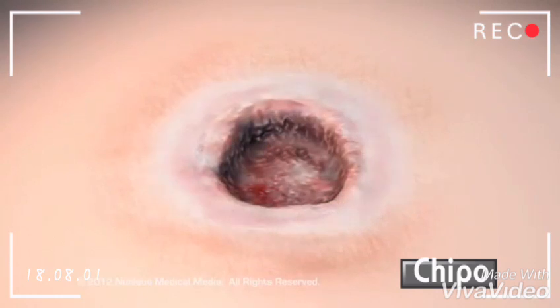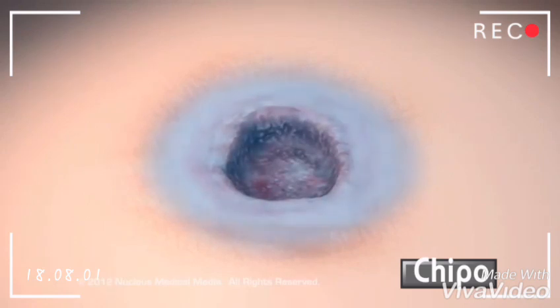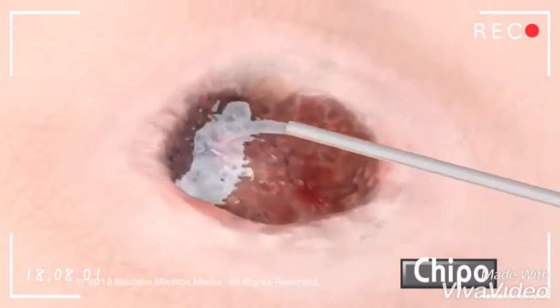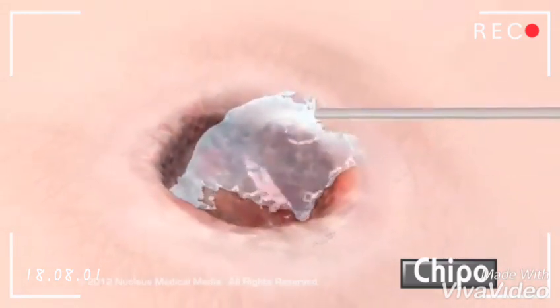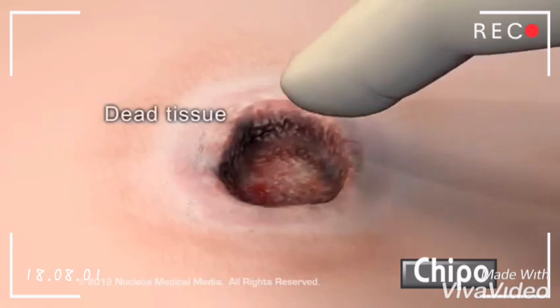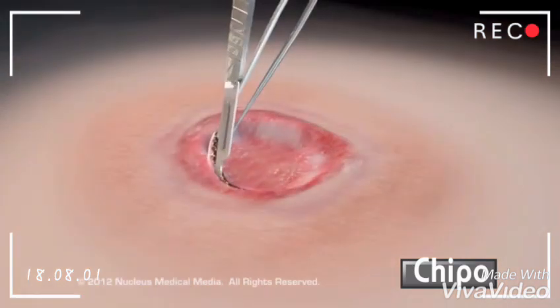Before the procedure, the surgeon may numb the area around the wound with local anesthetic. For more extensive debridements, a general anesthesia will be used. To begin, the surgeon may use saline or disinfectant solutions to wash or irrigate the wound. Next, the surgeon will evaluate the depth of the wound, checking the extent of the dead tissue.